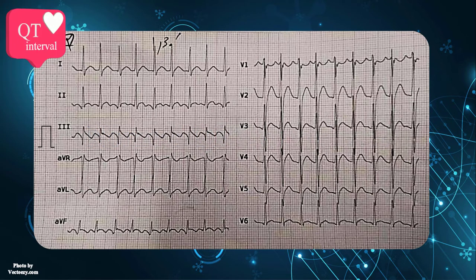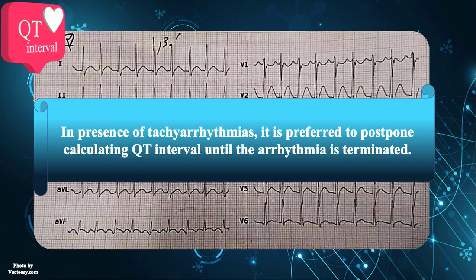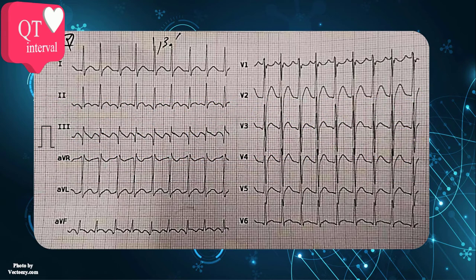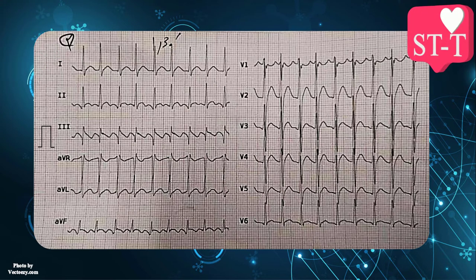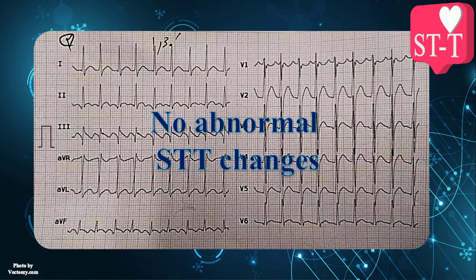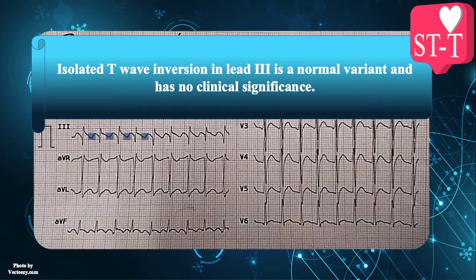Afterwards, we should calculate QT interval. Note that during tachyarrhythmias, measurement of QT interval is very difficult and time-consuming, so it's preferred to postpone calculating QT interval until the arrhythmia is terminated. The last thing in examining wave morphologies and intervals is ST-segment and T-wave changes. Fortunately, there is no obvious abnormal ST-segment deviation or T-wave inversion in this strip, so both ST-segment and T-wave are generally normal. Note that isolated T-wave inversion in lead 3 is a normal variant and has no clinical significance.